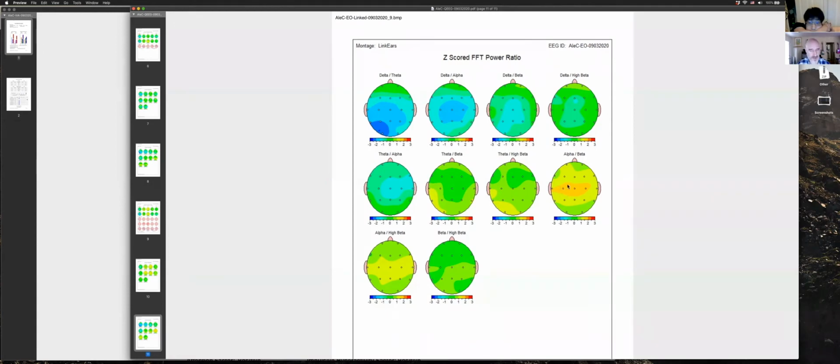So this particular one maintains focus when things drop in intensity. Meaning you're fine if things are dynamic and changing, playing a video game or a fight. But if things drop in intensity, you drift and go on autopilot, and it's a soft autopilot. Like if you read a book, 10 minutes in, you discover that your mind's been off doing something else. Your eyes are mechanically scanning the book, but not actually taking the information in. Yeah, I have that all the time. And this is exacerbated by sleep, but it's not a true ADHD phenomenon.